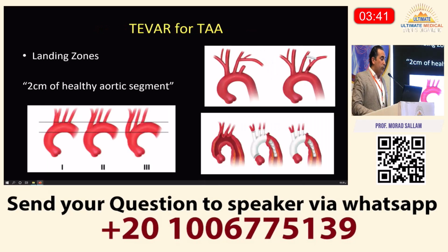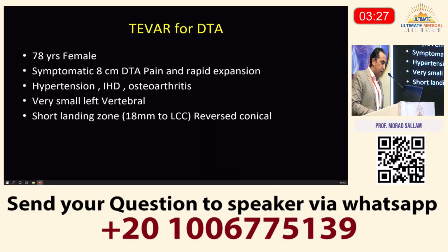So for TEVAR in thoracic aortic aneurysm with a 2 centimeter healthy segment of the aorta, you can extend that by some neck debranching, or you can create a frozen elephant trunk, or you can land in a total arch repair. All of these are ways to achieve a better landing zone. Now, this is a lady who is 78 years old, who came with a symptomatic 8 centimeter aneurysm with pain and rapid expansion.